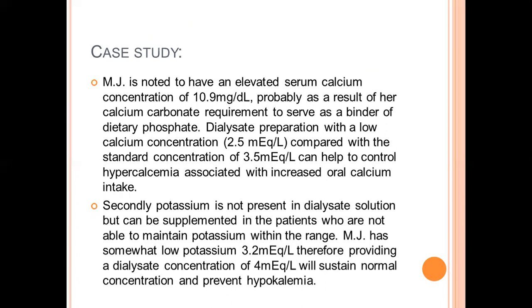Dialysate preparation with a low calcium concentration of 2.5, compared with the standard concentration of 3.5, can help to control hypercalcemia associated with increased oral calcium intake.